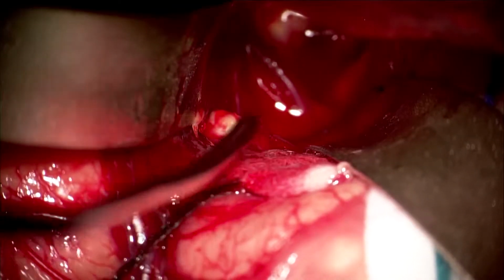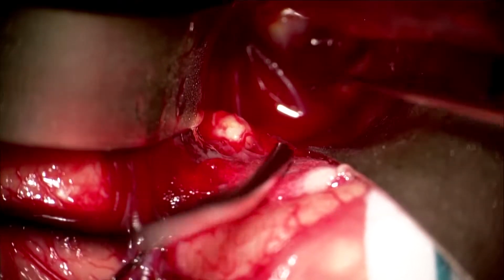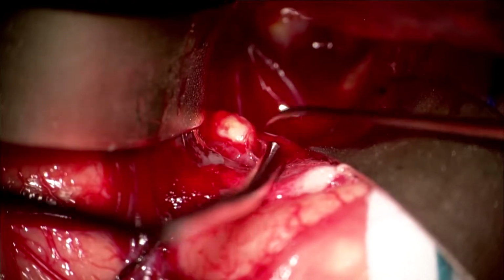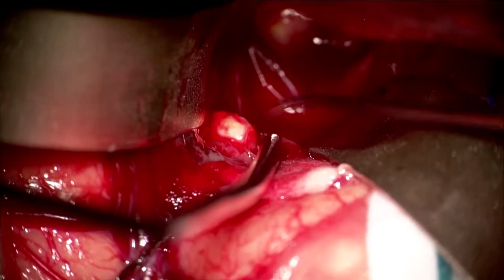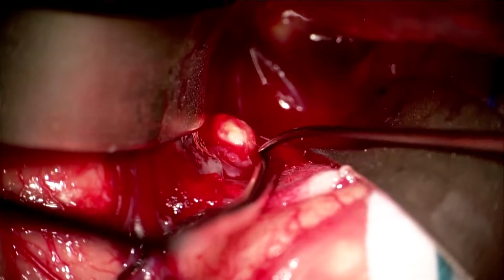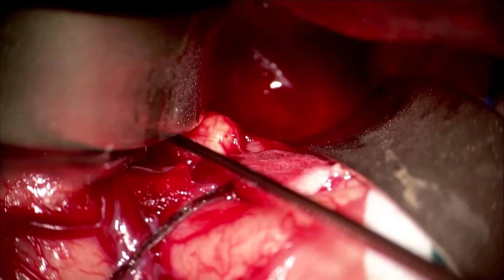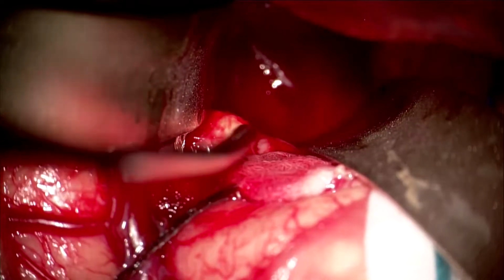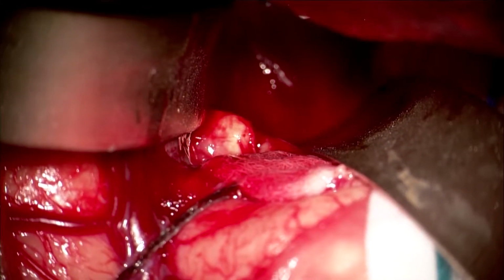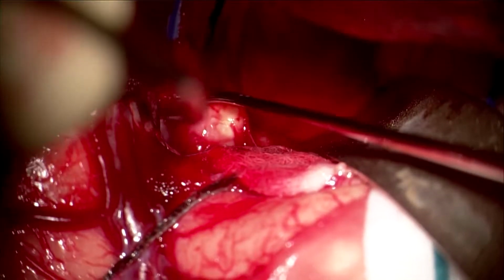Here we're starting to see the aneurysm better, and I will work to remove the adhesions as well as the normal brain surrounding the aneurysm off the aneurysm itself. On the left side of the aneurysm, I feel that the exposure is quite good at this time, and I'll further work to release that completely from the patient's temporal lobe.